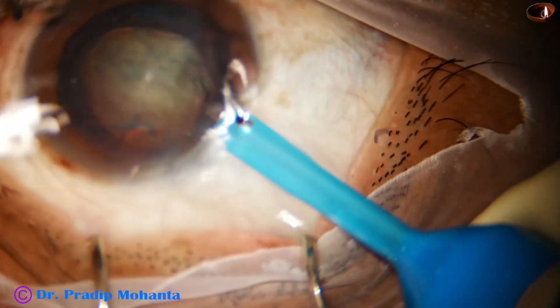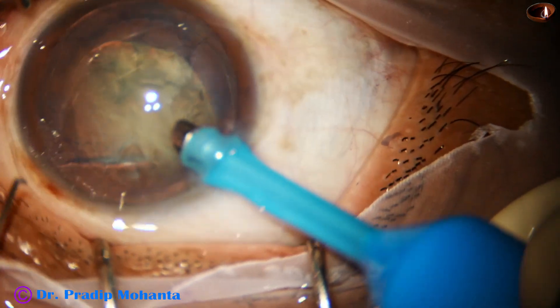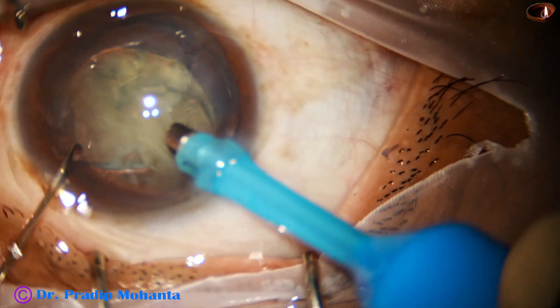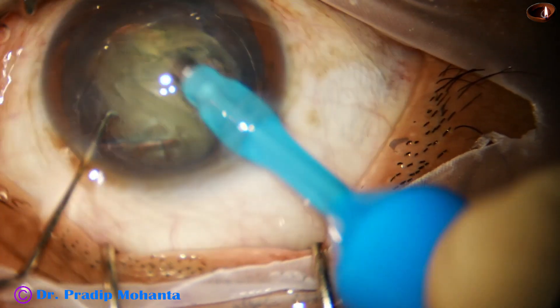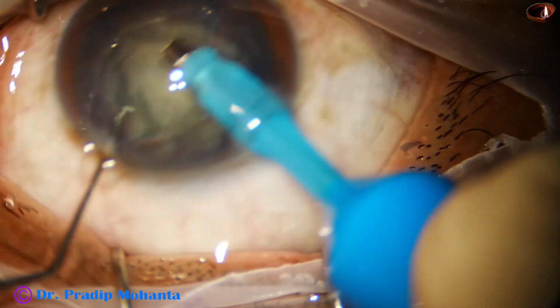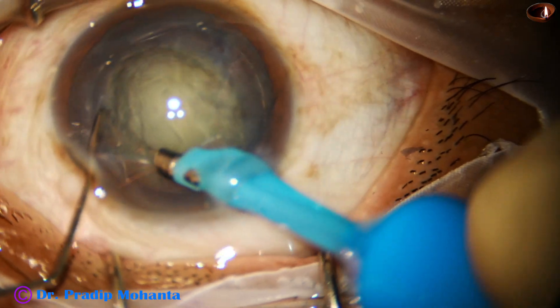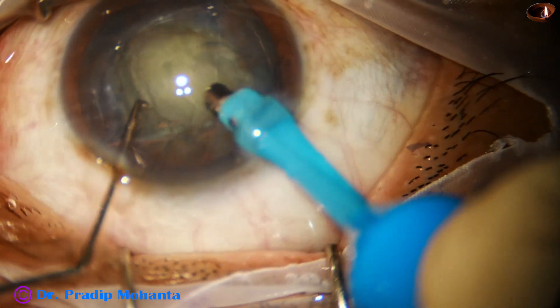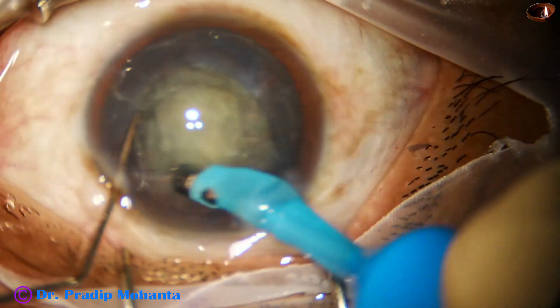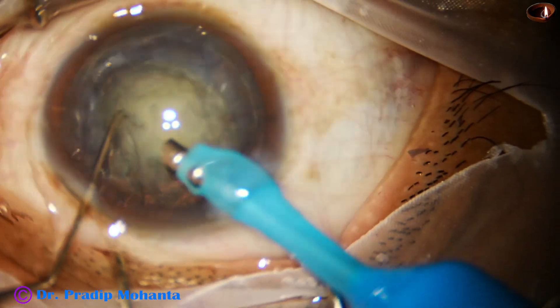Now here goes the feco needle — the feco needle goes in with its bevel down. Some superficial cortical lens matter is being removed by her, and this is a real-time surgery. Let us see how carefully she performs the direct chop.